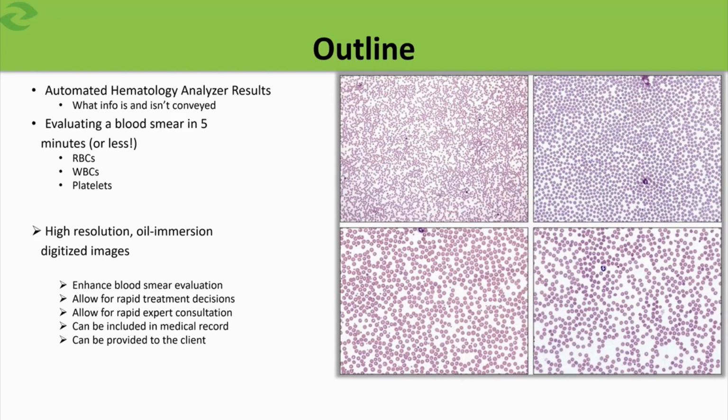Digital images also allow for rapid treatment decisions, primarily because not only can you get the image into a viewable format, zoom around, and even capture some of those images, but if you need an expert consultation, most laboratories that are providing digital microscopy or consultation services can turn that around within about 2 hours or so.